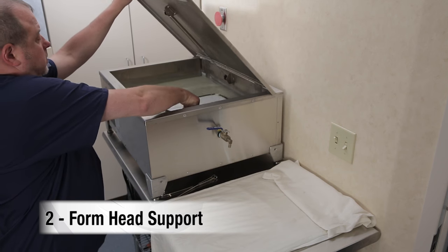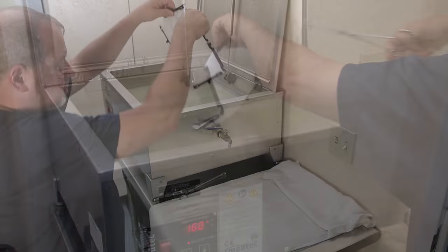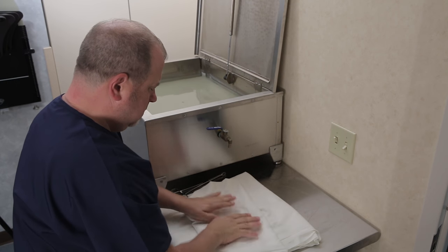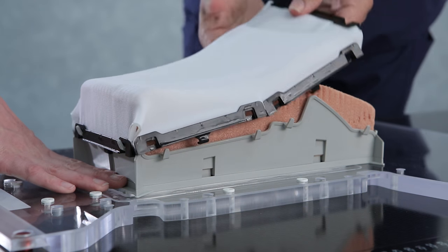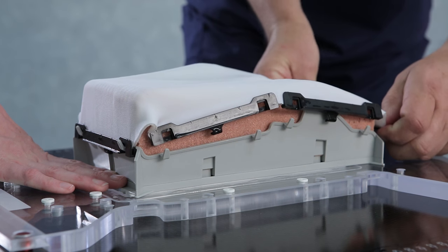Place the thermoplastic sheet into the water bath. Refer to your manual for heating times. Apply the sheet with the wide part positioned superior over the head support. Stretch the sheet itself, not the black pieces, and lock the sheet into the head support.